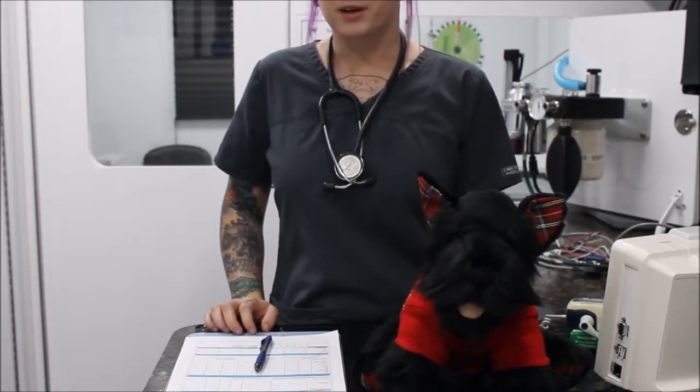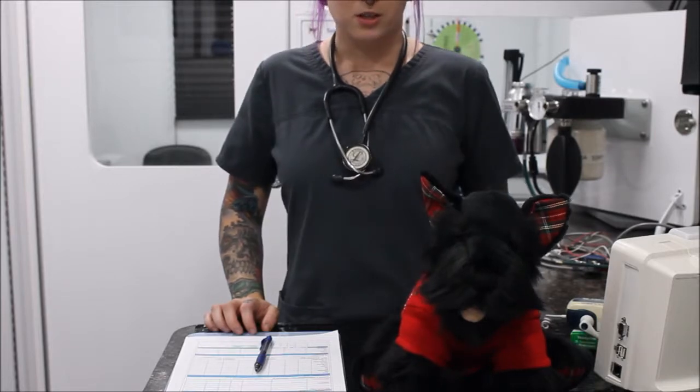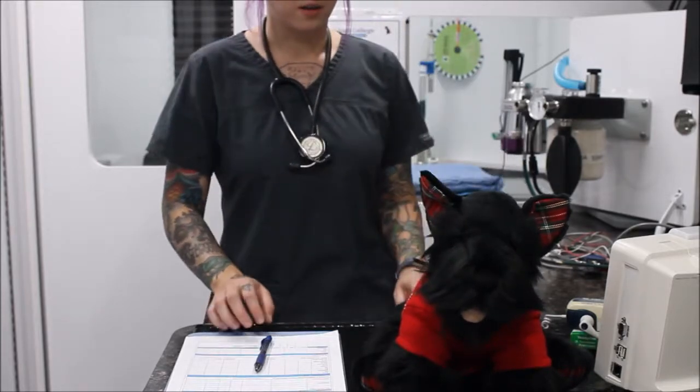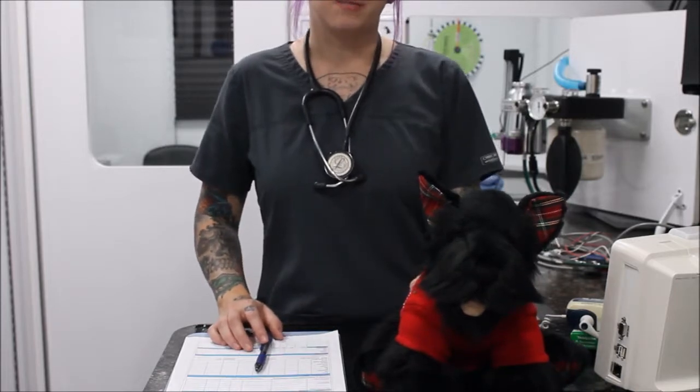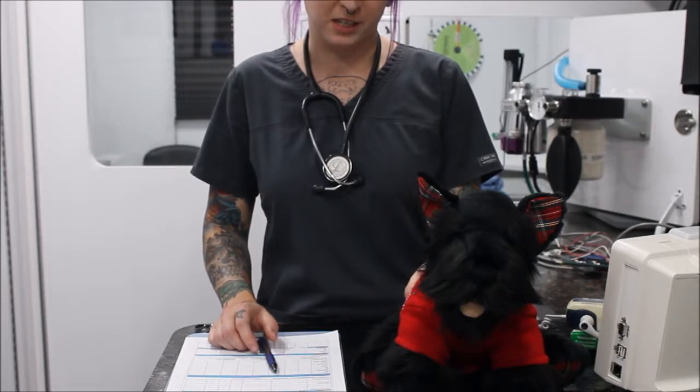So for this task, we're going to go over monitoring anesthesia using anesthetic charts. The first thing that I want to do while I am monitoring my patient is go ahead and determine the physiological status of my patient under anesthesia.